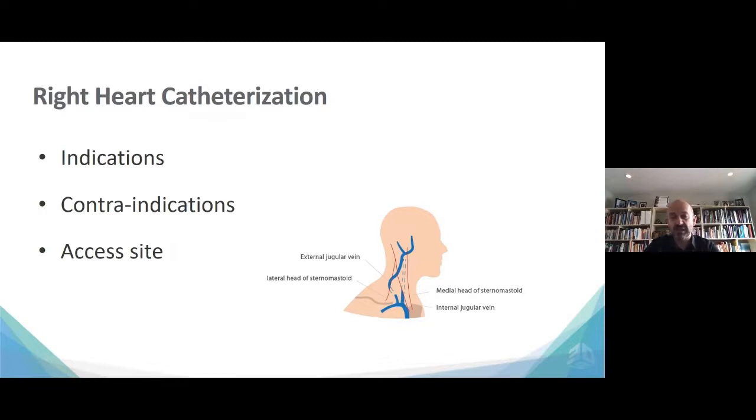It is really, really difficult to navigate a PA catheter without fluoroscopy from the femoral access route. You could get lucky, and I have to say I've gotten lucky once with that, but it was pretty much because of lack of knowledge. So just don't do it. I think you should go to the cath lab.